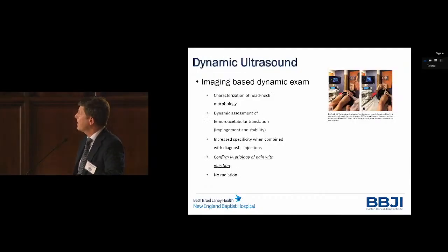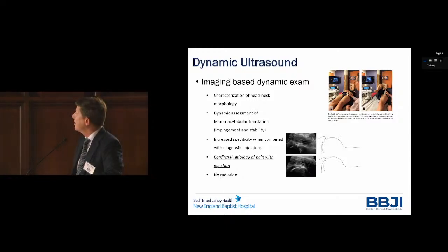I just want to go briefly to dynamic ultrasound. I mentioned this briefly this morning. Basically, you take the patient to an apprehension position and measure the femoral head translation while you're dynamically moving the hip. So it gives you some sense of instability in the broadest term, right? And while you're doing that, you can also do a nice injection. So again, you want to confirm before you scope that there's a really intra-articular etiology of pain. I think that's really important, and Jeff mentioned it this morning as well.